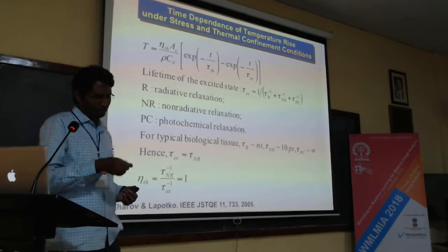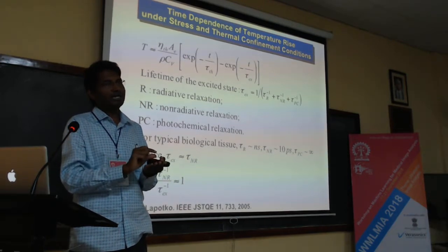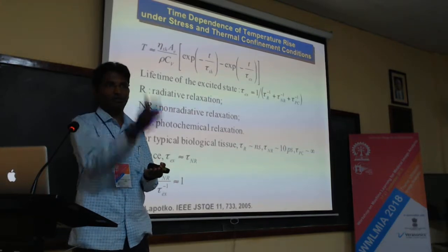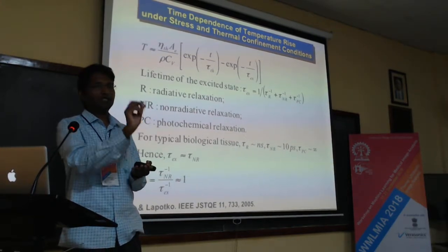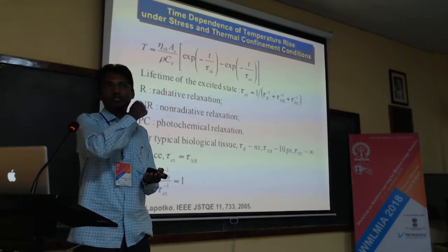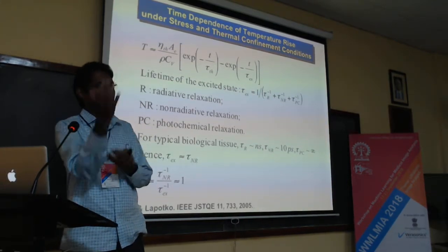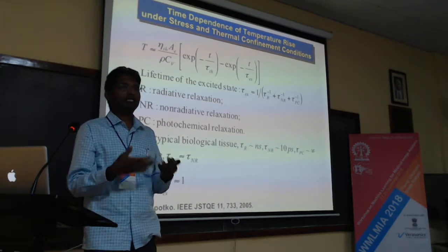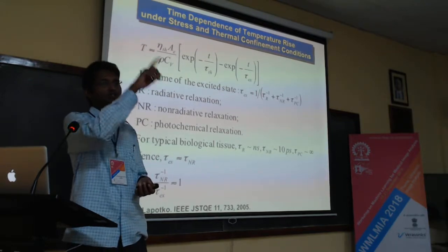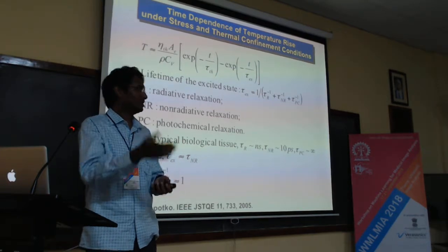Remember, when we send the pulse laser, for a small time the temperature is going to rise, and because of the diffusivity, the temperature rise is going to fall down very quickly. You can say the temperature rise is what is called an excited state. That is the energy which has been absorbed because of the laser. Now it has to come down to the ground state, which means it has to emit that as a sound wave. So what is the lifetime of that excited state? I need to go back and look at how fast my ultrasound detection scheme should be, and what frequency I should be using. This essentially gives you that.